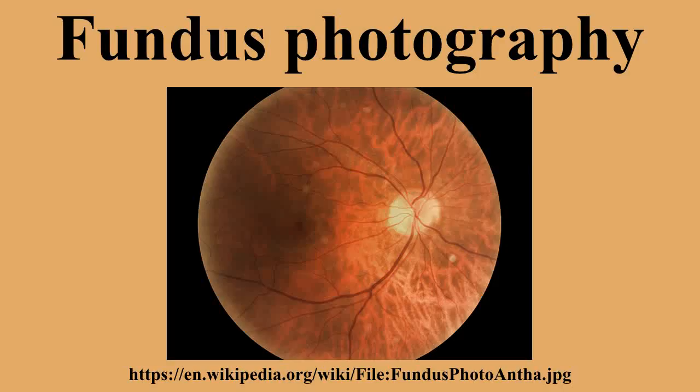Fundus photographs may be useful if there is a new disease affecting the fundus and for the planning of additional management options. The medical necessity of fundus photography and other diagnostic imaging must be recorded in an orderly fashion so that the clinician is able to compare photographs of a patient from different timelines. Documents of a patient's medical record must consist of a recent relevant history, progress notes and fundus photographs depicting and supporting the relevant diagnosis. The photographs need to be labeled appropriately, such as with the date and patient details.